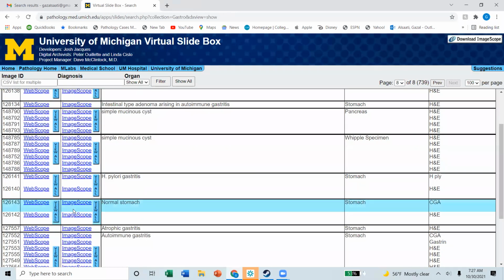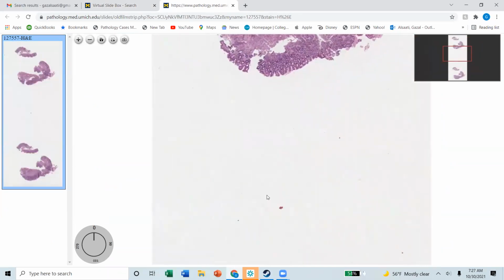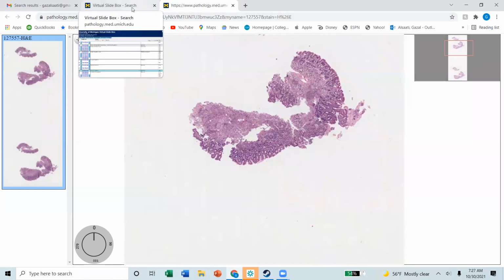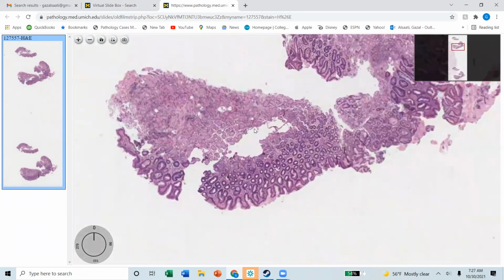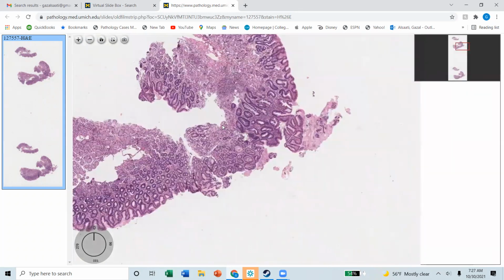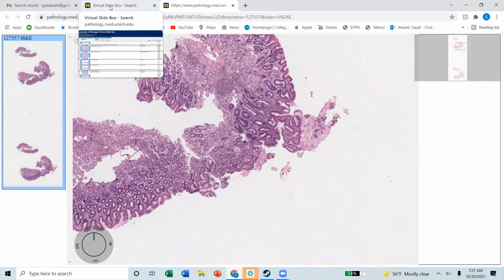Cool. Knowing histology is very important. Alsaati, can you please go over the gastrin stains and how, in autoimmune gastritis, it will be helpful? Yes, please? Of course, of course. Thank you. So this is basically a case of autoimmune gastritis. Dr. Alsaati, can you explain to her what happens with gastrin in autoimmune? Does it disappear or? Yes, yeah. I'm about to say that, Akanksha.